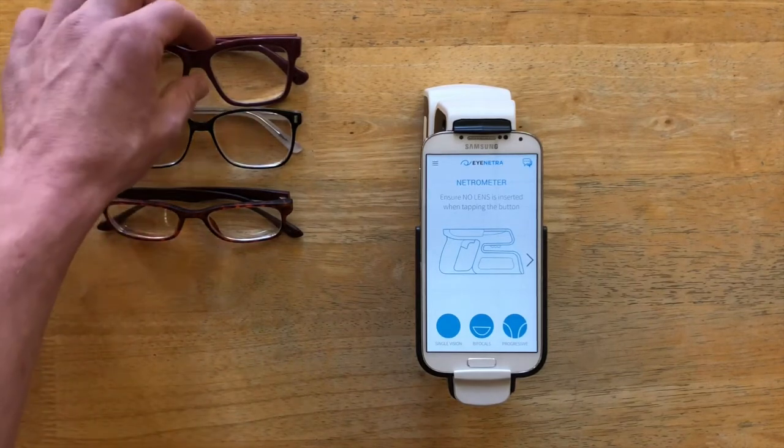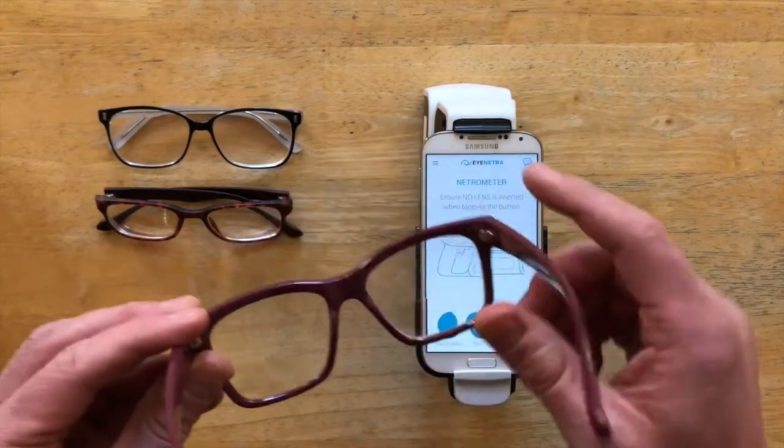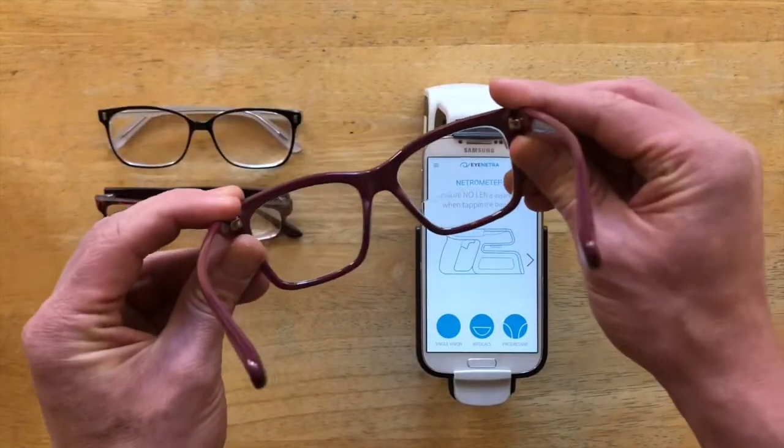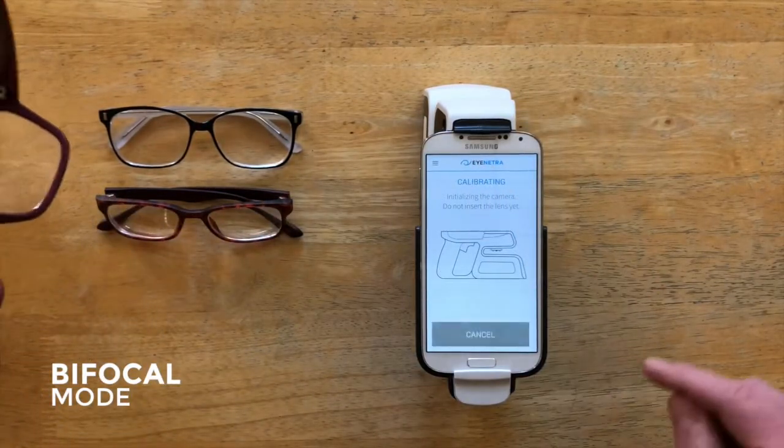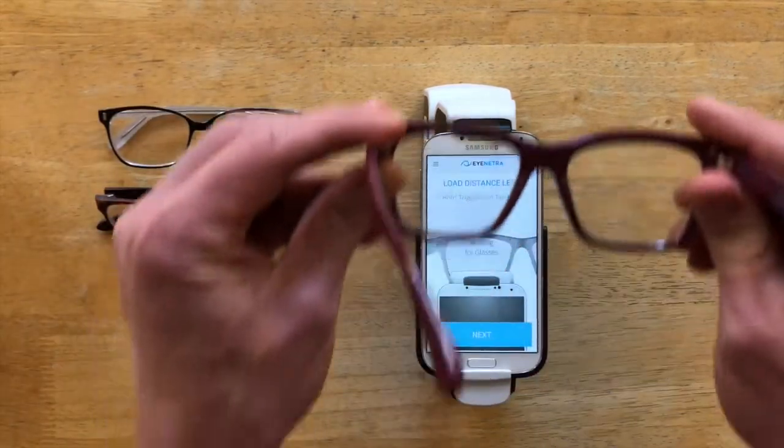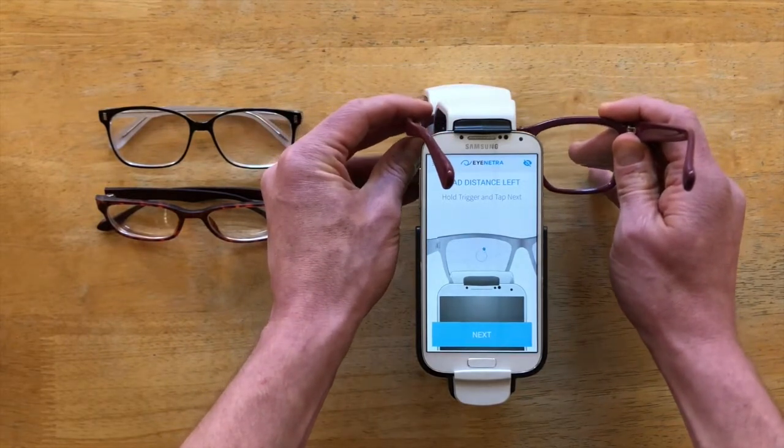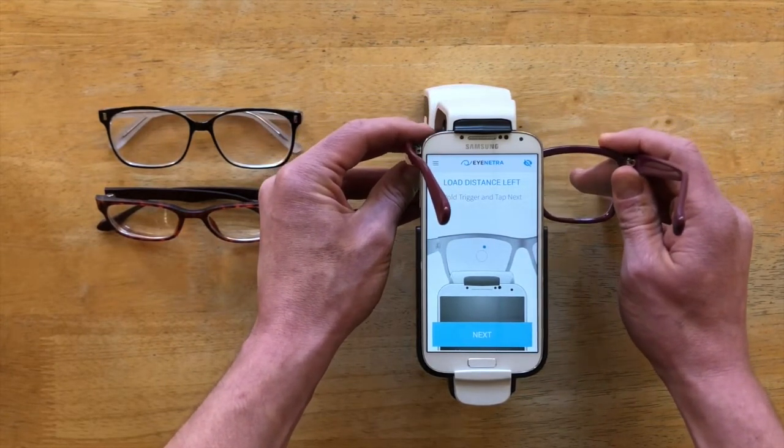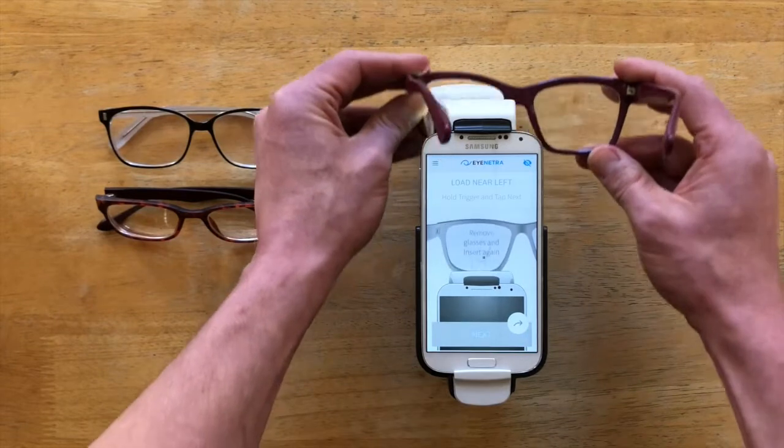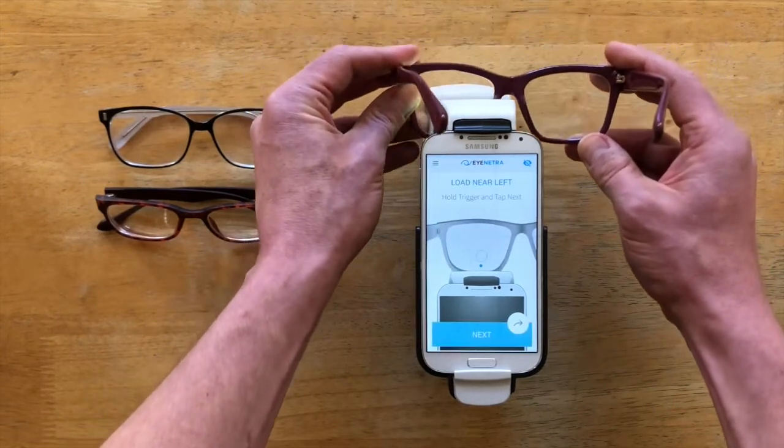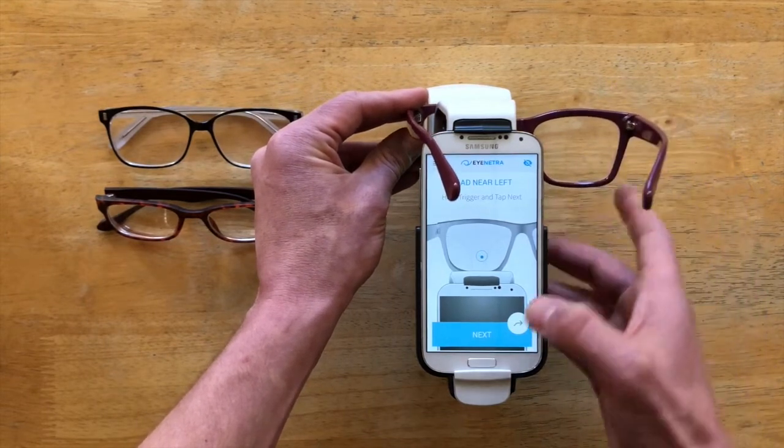Now the process for bifocals is very similar to progressives. There's just one tiny change. The only change is that after I measure the distance portion, I'm going to remove my glasses and then reinsert them to grab the add value. So let's show you how that works. I'll select bifocals, allow the device to calibrate. Again, I'll begin with the left lens, insert the glasses, find that distance measurement, and tap next. And then I'm going to remove the glasses and then reinsert them slowly. There we are. And tap next.